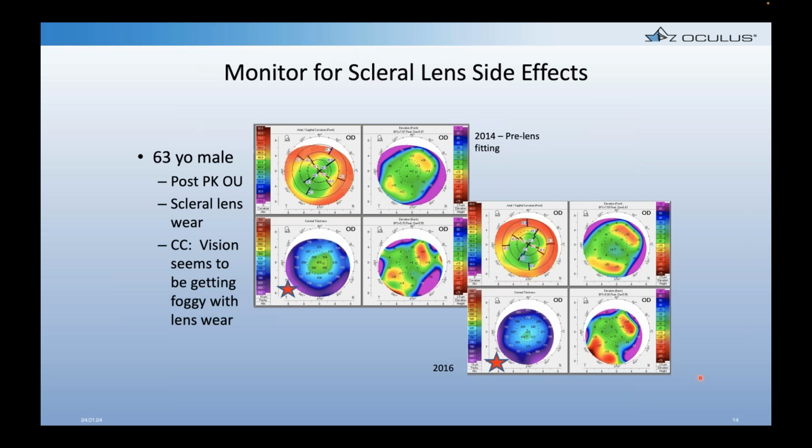Beyond the diagnosing and management of corneal disease, we also can monitor for side effects from our lenses. And again, having the corneal thickness measurement of a tomographer going for us. It's not that you couldn't do pachymetry with a handheld pachymeter, but in this case you get the full corneal shape data, whereas a pachymeter is giving you data about one spot. And so if you're looking for subtle signs of corneal edema, you may not always detect that very accurately with a basic ultrasound pachymeter.